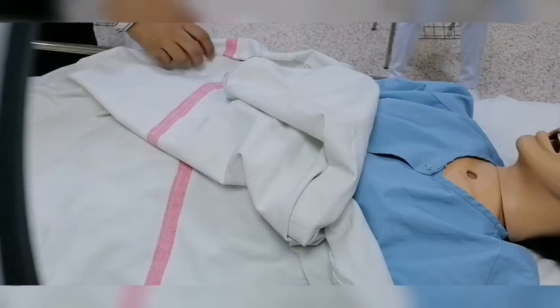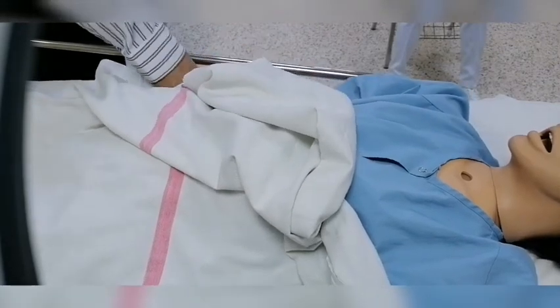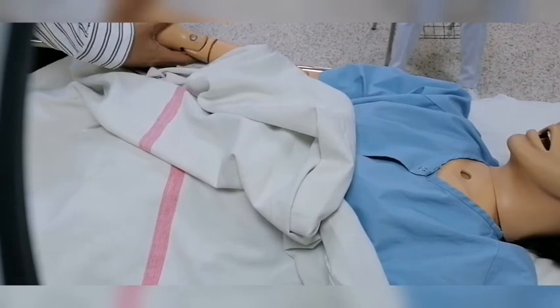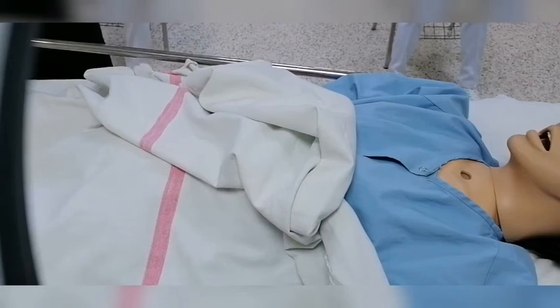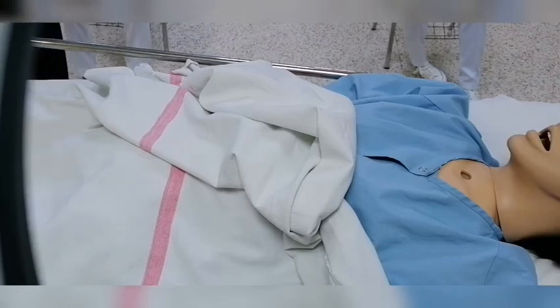Then you have to verify also the client name by asking his name, and also verifying the client name by checking the ID band from his hand. So we have to verify it by two methods. Then we have to put the curtains for the privacy. So those are basic things before doing any procedure.